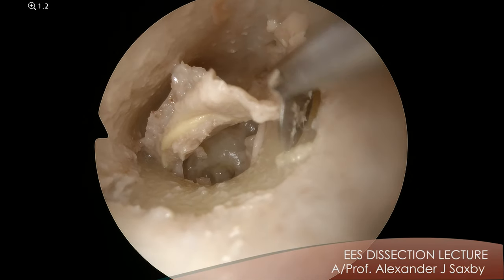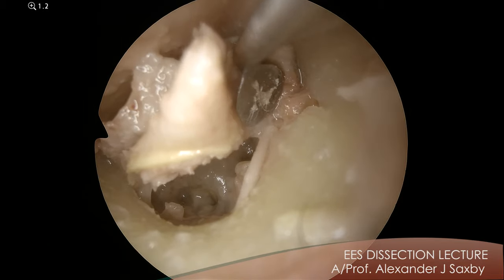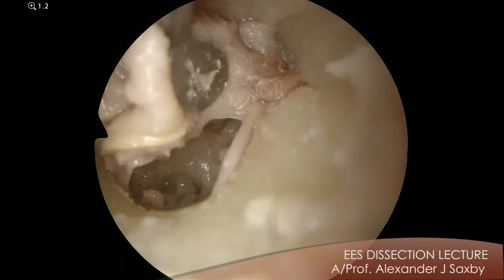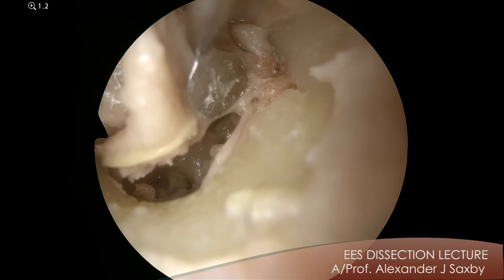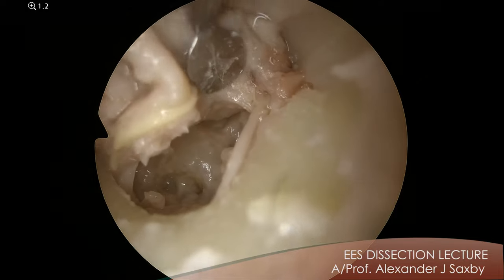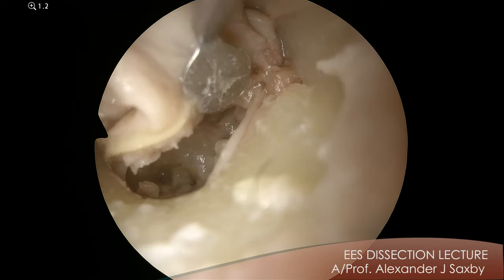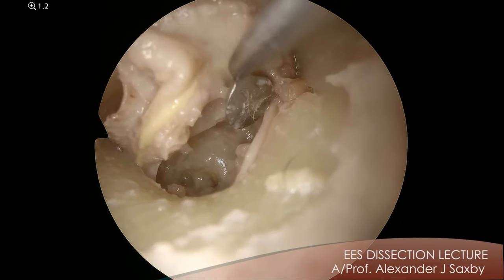So we're going to look at the attic now. When you're doing your dissections, go very slow at this part because I want you to see Prussak's space. By pulling the eardrum down you'll see where the chorda tympani goes under the neck of the malleus. You can follow the chorda and it's a very nice landmark in real patients as well. You'll eventually start to see the malleus handle and you'll see the chorda going underneath the neck of the malleus. Slowly just edging that tympanic membrane off the chorda — the chorda is your highway. It's like the digastric. It's your friend. Use it for anatomy.